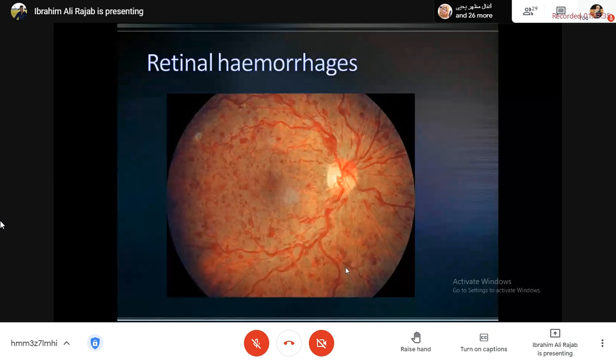Yes doctor. Yalla Ayat. Your colleagues talked about the optic disc and said the blood vessels are more tortuous. Continue for us Ayat. There is a flame-shaped hemorrhage and blot hemorrhage. Yes, there is a flame-shaped hemorrhage. You notice that the flame-shaped hemorrhages, all these hemorrhages, thank you Ayat, look to be directed toward the site of the optic disc. And there is a dot blot hemorrhage, as Ayat Abbas said, because this case is caused by central retinal vein occlusion.